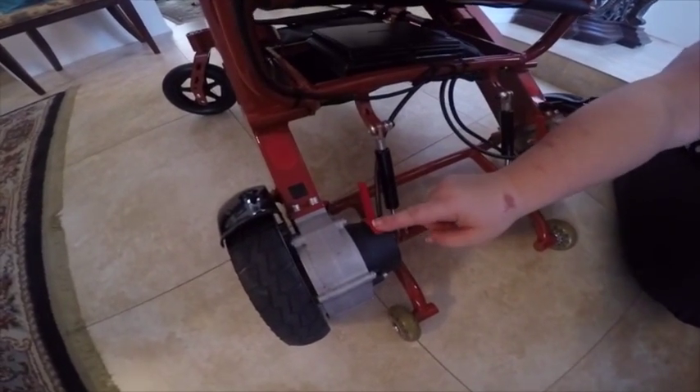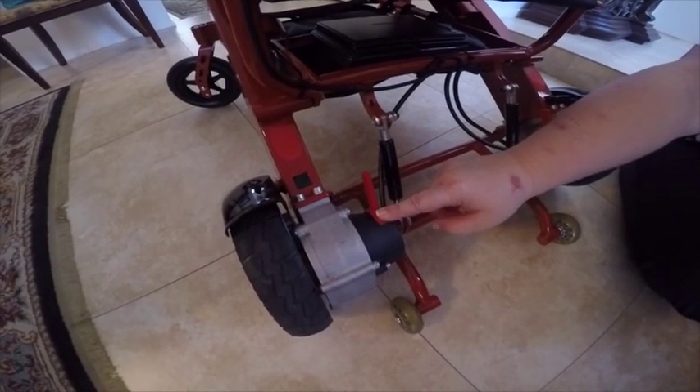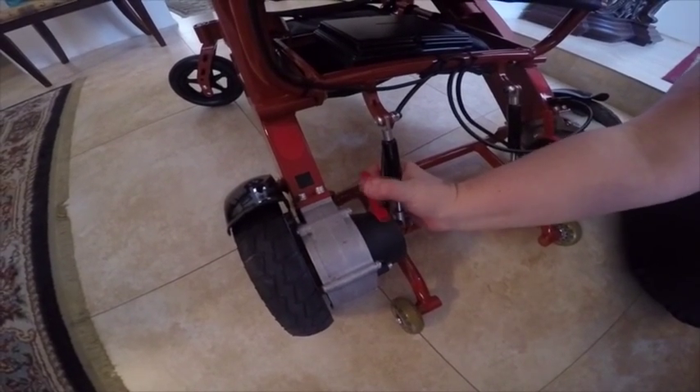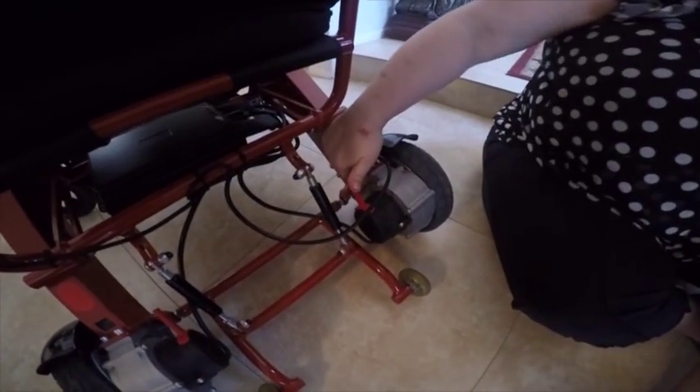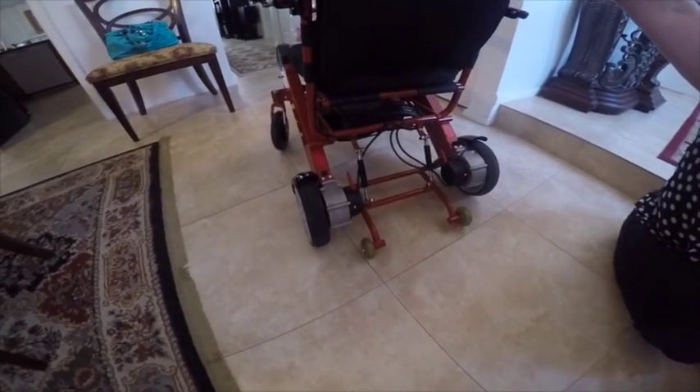First you'll notice these red levers next to each wheel. You're going to push those forward till you hear the snap on both sides. Then you'll notice that you can push the chair and the wheels engage.